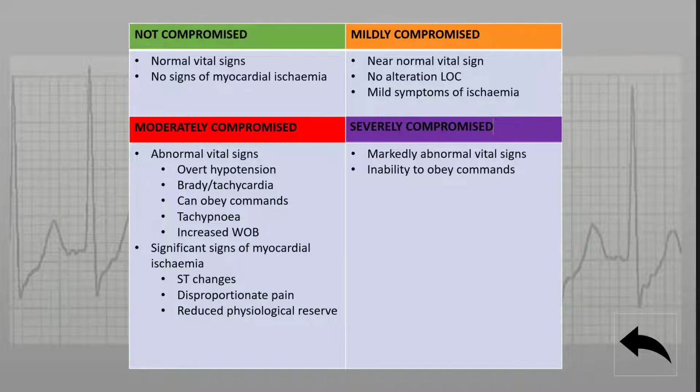Many of these patients will have subtle signs of neurological hypoperfusion, and in some cases, severe hypoperfusion will reduce the patient's GCS to a figure below 15. Management of tachyarrhythmia by electrical cardioversion implies that you have assessed the patient and found them to be severely compromised.